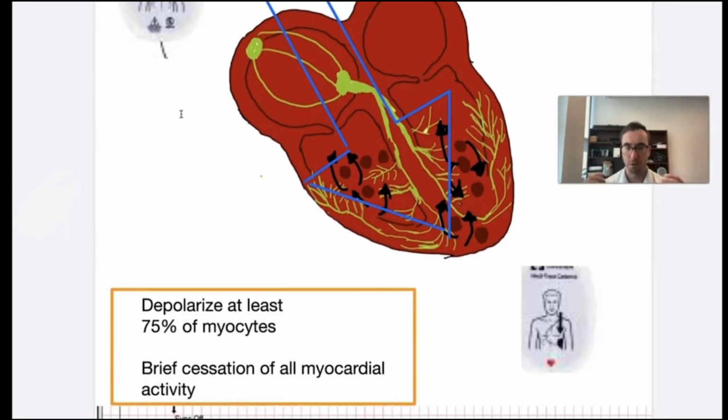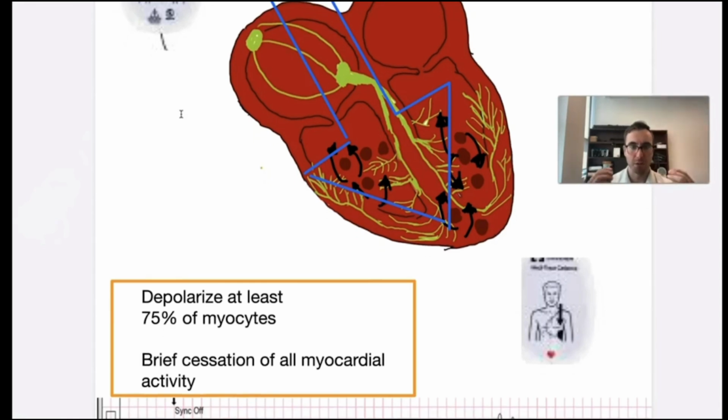We start with standard defibrillation because it depolarizes the largest portion of our myocardium. It's quite effective. But the problem with it is, after 3 consecutive shocks, maybe the patient needs something different. And again, after 3 consecutive shocks, patient mortality goes up. So it's like we need a new treatment option.